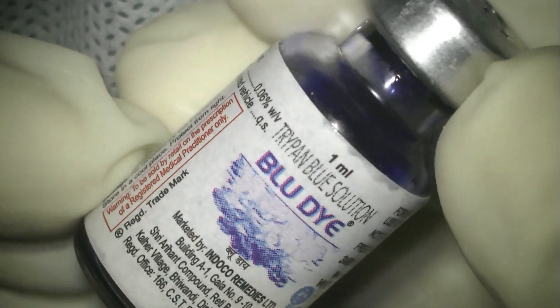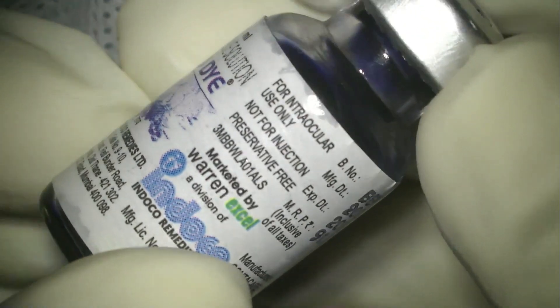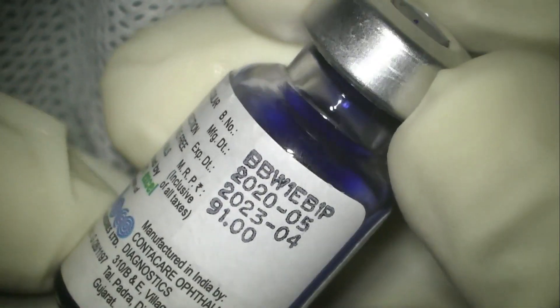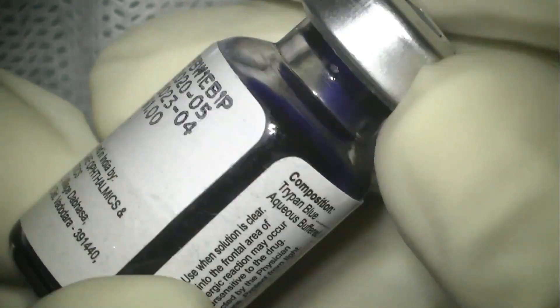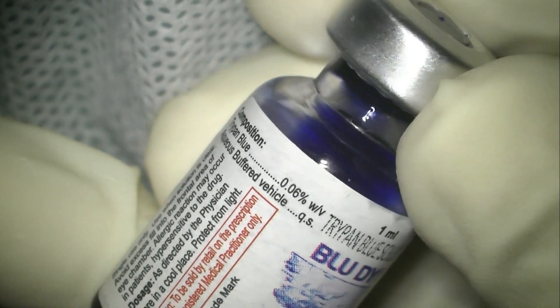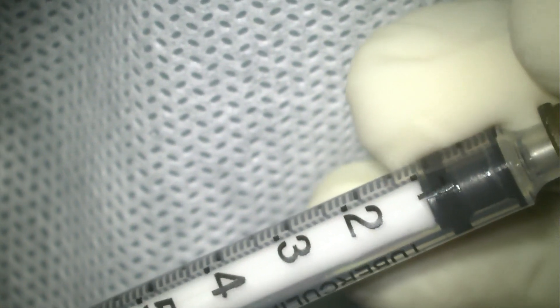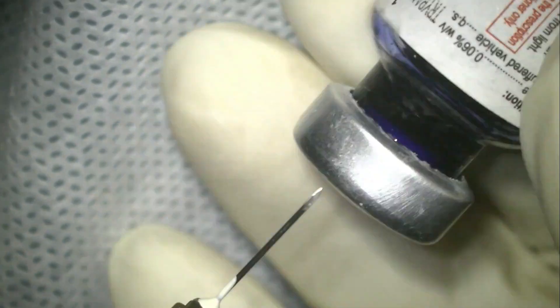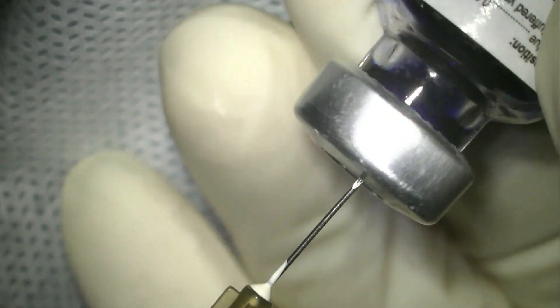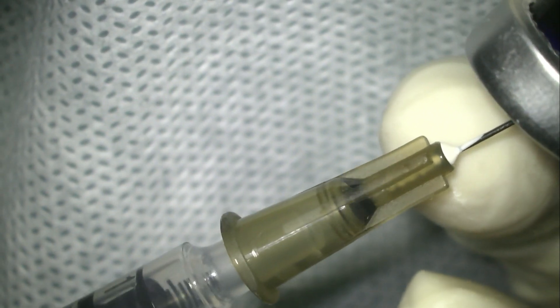Now let's move to the blue dye injection itself. This is a vial containing 1 ml of trypan blue solution. At the outset it's very important to check the expiry on the blue dye bottle and note the composition of trypan blue in this solution. The next step is taking a 1 ml syringe connected to a 26-gauge needle, as demonstrated here, and drawing approximately 0.1 to 0.2 ml of this solution from the vial.